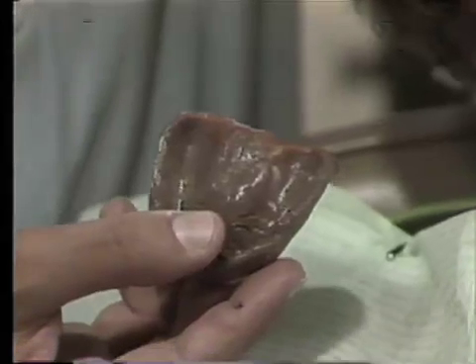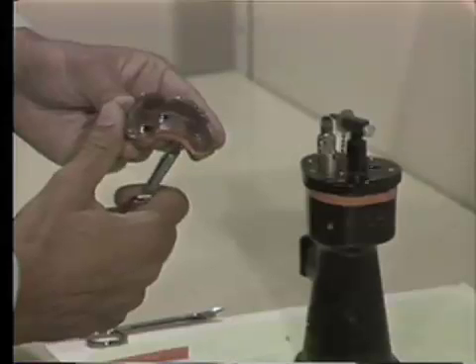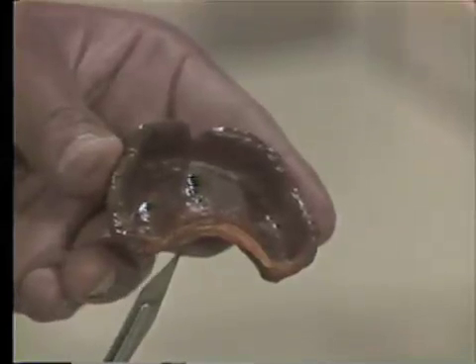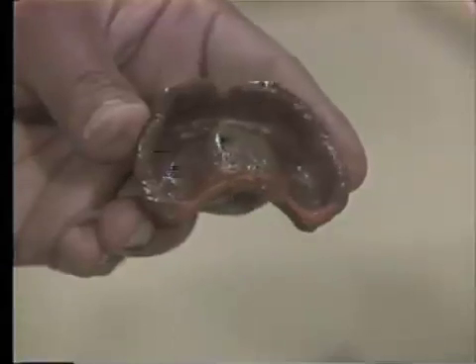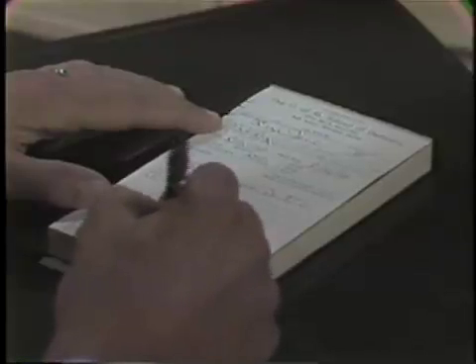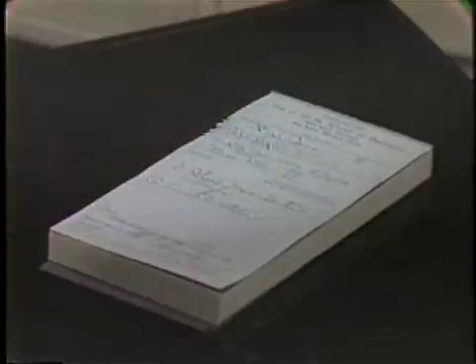You must be certain that the wax has flowed in the mouth and can be seen to overextend that part of the posterior border. This excess material should be removed before the cast is sent to the lab. A laboratory prescription is filled out and the case is sent to the laboratory. Do not pour the impression in stone — the laboratory will do this for you.